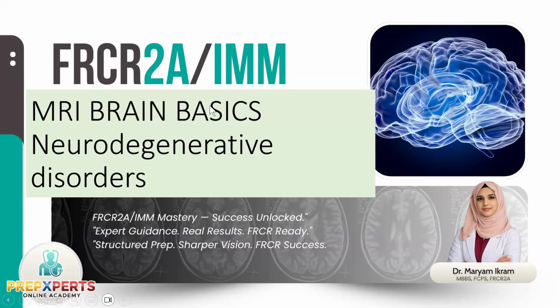So this MRI brain basics is, I must say, the crux of the whole MRI related questions. When you know the basic sequences, when you know the simple concepts like how the blood appears on the specific sequence, how metals alter the sequences, and anatomy, you will be able to exclude or include a lot of differentials while attempting the exam.